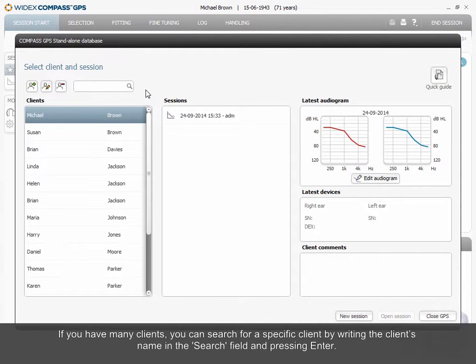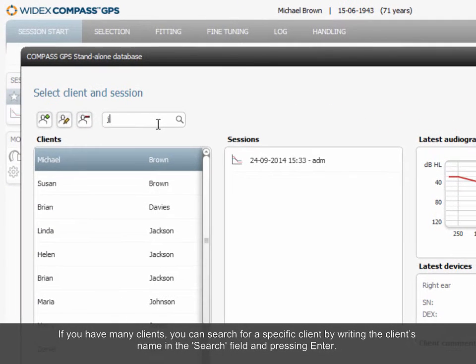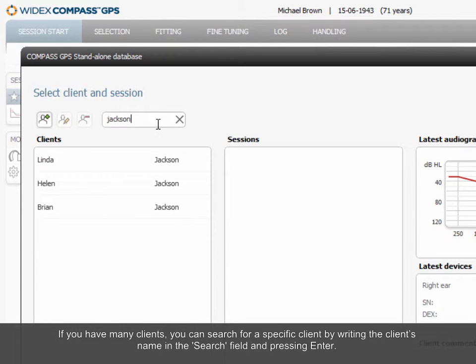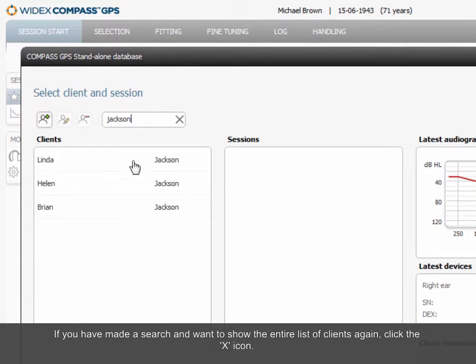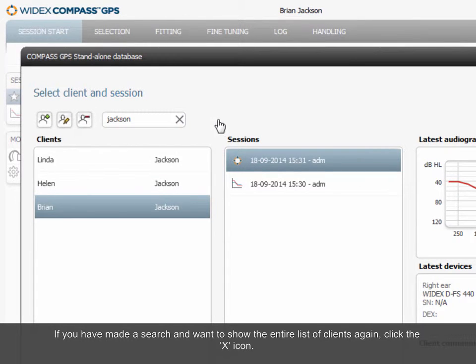If you have many clients, you can search for a specific client by writing the client's name in the search field and pressing Enter. If you have made a search and want to show the entire list of clients again, click the X icon.